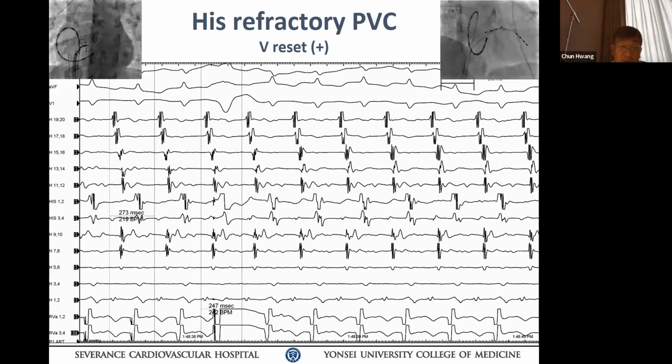Oh, this is something different. 근데 보시면은 his 봐, his 3, 4. his 3, 4에 A 있잖아. 봤어? his his bundle 3, 4. 조금 더 뒤로 와. 조금 더 중간 트레이싱 중간 정도 와봐. 나이스 his A 보이잖아. 더 와. 오른쪽으로 쭉 빼. Keep coming. 더 와. Next bit. Go to next. Keep going. Next. 거기 지나갔다. 그거다. 거기 A 보이잖아. A. 포인트 A. 아니, 그건 B고 A. 중간에 있잖아. 그게 A. 그렇지.